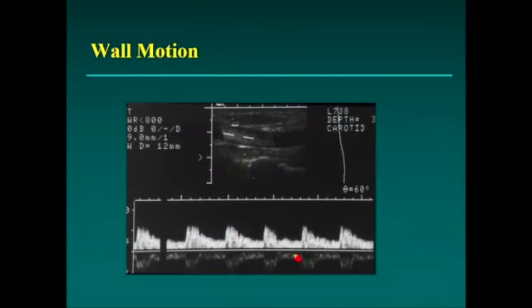You can, if you open the range gate too high, and this again is sort of ridiculously high, but you know it makes the point. I've opened the range gate to encompass the entire carotid artery, and you get something that shows, well, I guess you could argue spectral broadening and an unusual waveform, because you're picking up that wall motion.